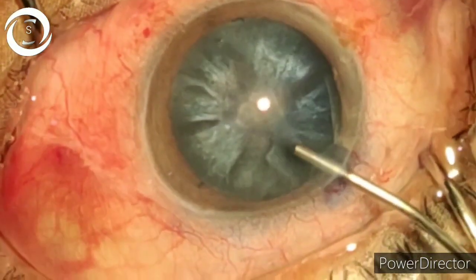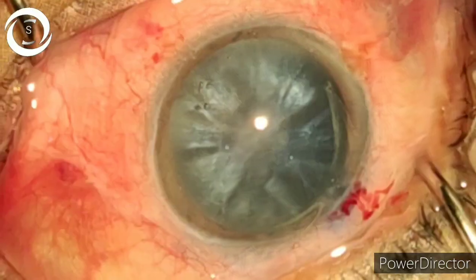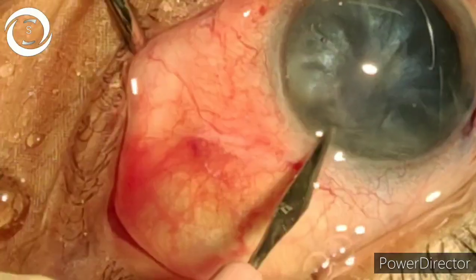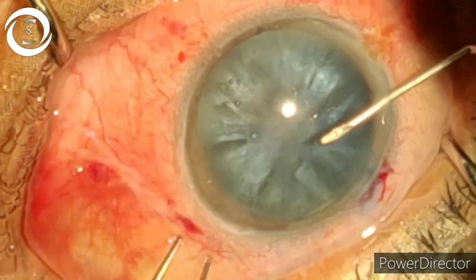Now put viscoelastic. The trick of doing such a hard cataract with phacoemulsification is to put as much viscoelastic as possible. Now the right side port is for the capsulorrhexis and the left side port is for fine irrigation expression if needed.